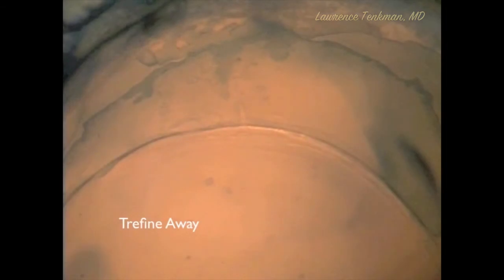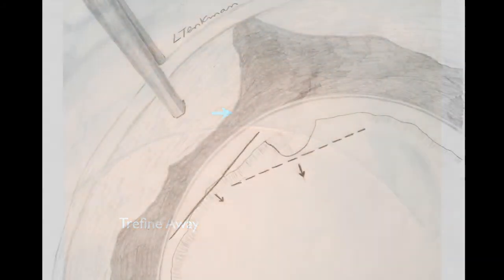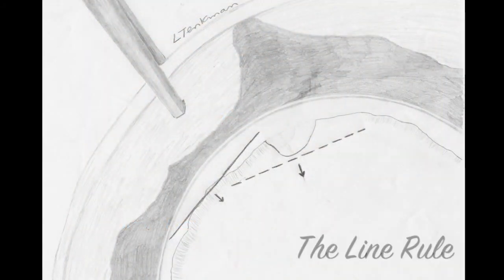The tissue can be positioned to trephine away the horseshoe tear so it is not present on the final donor. During DMEC prep, a good guide for minimizing tension during peeling and free-up is the line rule. Imagine a line drawn tangential to the portion of tissue you are working on. If neighboring tissue lags behind this line, you are in violation of the line rule — that adherent lagging tissue will stress the area you are working on and cause tears. Always start with the most peripheral tissue so you are always working on Descemet's membrane with minimal tension from neighboring tissue. The solid line in the picture demonstrates a point in agreement with the line rule, while the dotted line would not be a good starting point — you would only come to that valley after first addressing its neighbors.